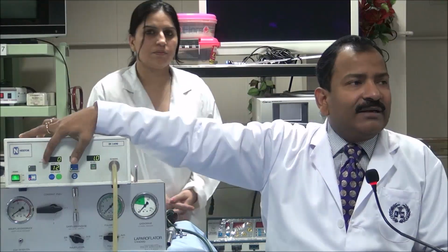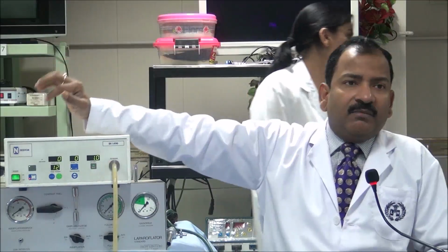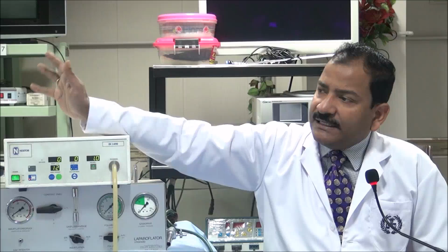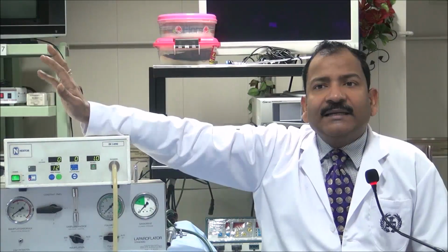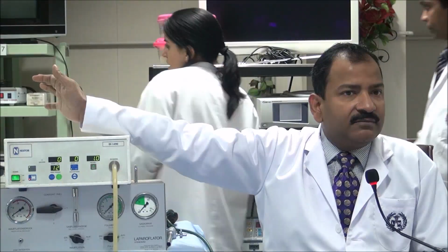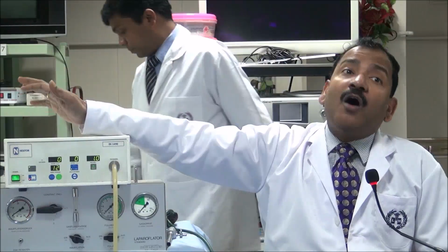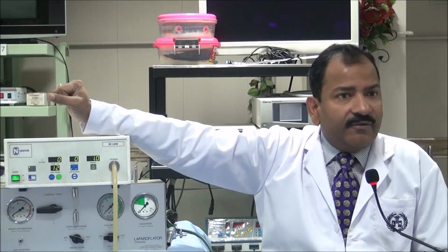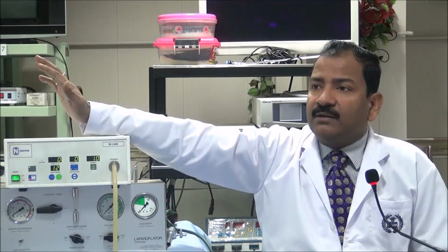After 600 to 700, it will come to 4, 5. After 800 ml, it will come to 6, 7. After 1 liter, 9, 10. And after 1.5 liters, 12. I am not talking about a very tall person. Average Indian height, 5 feet 4 inches, but a very tight abdominal wall.